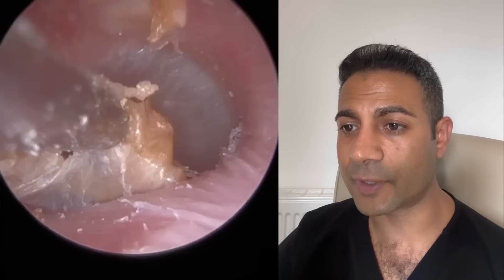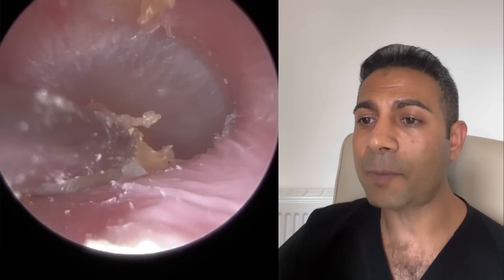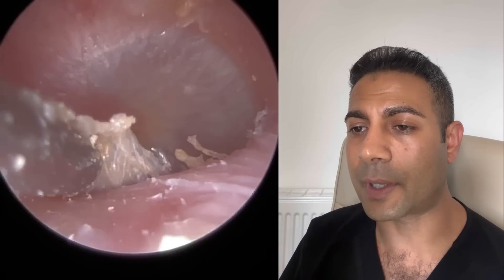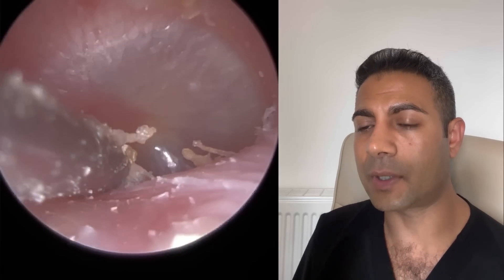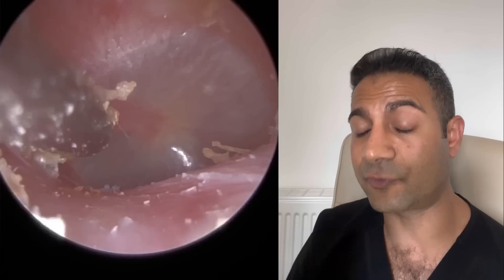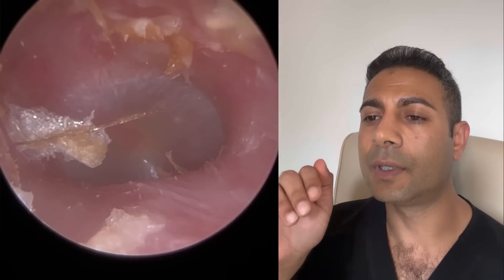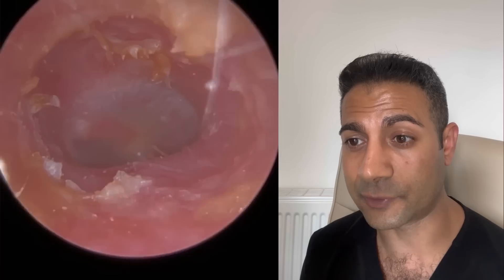We're working quite close to the patient's eardrum now. There's this thick blanket of skin in the inferior recess. This patient's ear canal was quite inclined to an upward slope — most adult ear canals have an upward slope around 32 degrees, but I would say this patient's is a bit more than that. As it approaches the eardrum, it goes back down again creating a valley — that's the inferior recess. Even with an endoscope, it's really difficult to examine and inspect the inferior recess, especially with this patient's quite upward trajectory in the outer canal.